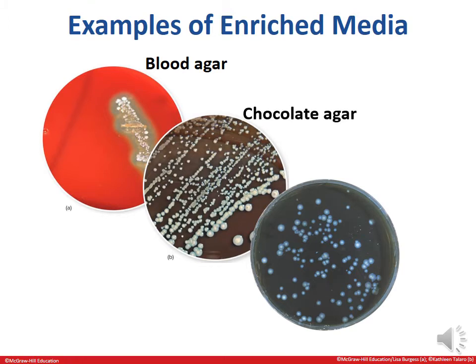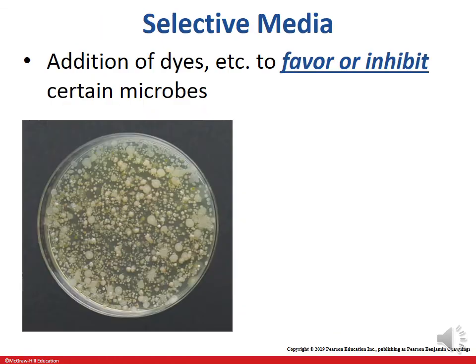Chocolate agar sounds yummy, but there's no cocoa involved here. This is actually cooked blood, which gives it that brown color. But this is an important type of media that they use to diagnose gonorrhea, for example. Neisseria species grow best on chocolate agar. And then there's a disease called Legionnaire's disease, which is a respiratory infection that is specialized on this charcoal yeast agar. And so these are very definitive diagnostic tests that use these very special kinds of media that allow only certain things to grow, or at least it allows us to have more specific diagnostics.